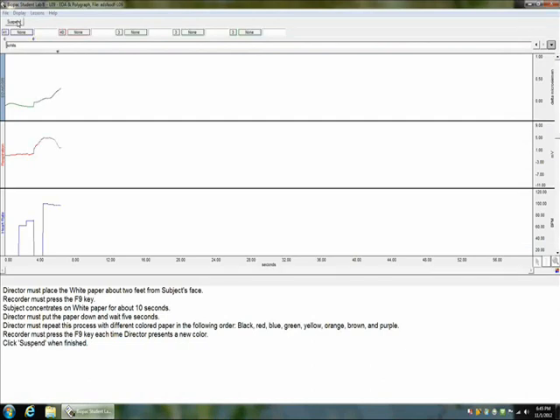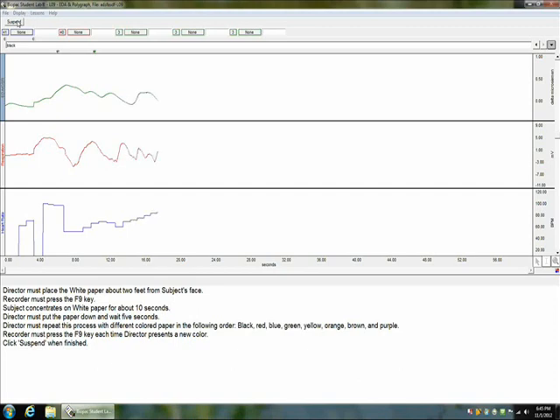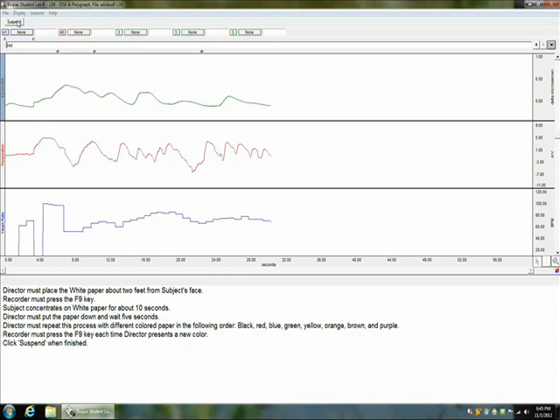Now, once the experiment has begun recording, one of the most important things the recorder is going to do is add markers at important points throughout the data collection. This can be done by hitting the function key F9 at the top of the keyboard, and all of the points we are going to want to do it at are stated on your role sheet. As you can see, the markers are being added above the graph, and they look like squares with little triangles in them. These markers are going to be used later when we're analyzing our data, and it is important that they are not only in the right position, but are also labeled correctly.